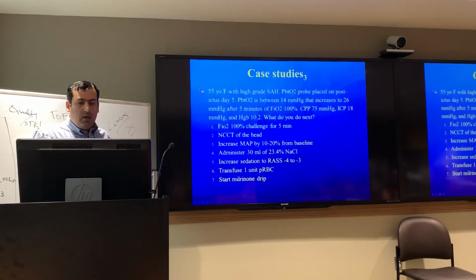Okay. Your PbO2 is 14. It goes up to 26 after 5 minutes. So it's working. CPP is 75. ICP is normal, 18. Hemoglobin is 10.2. What do you do next?